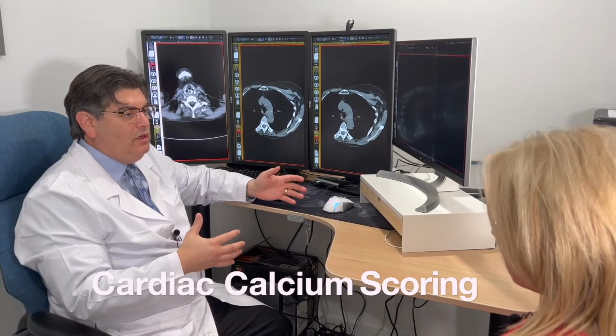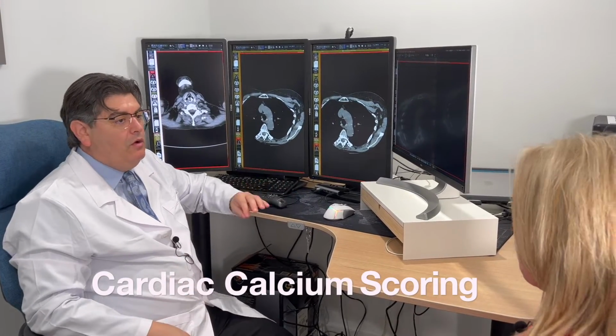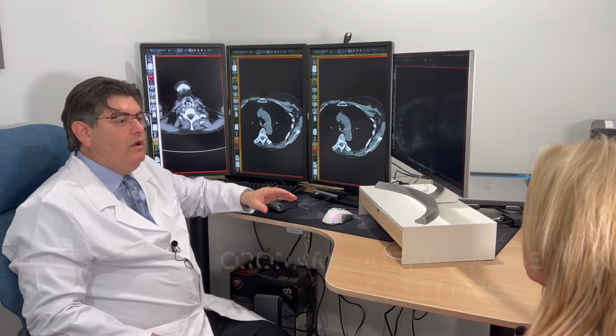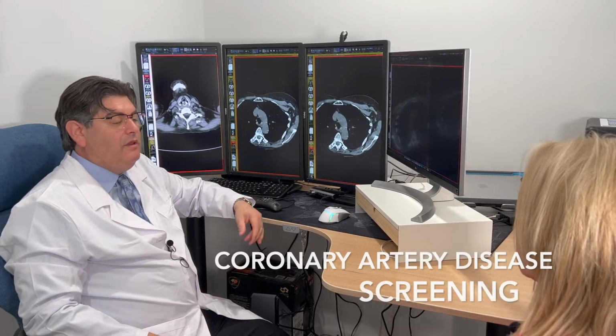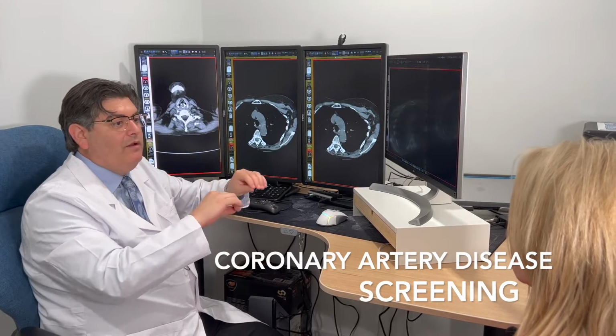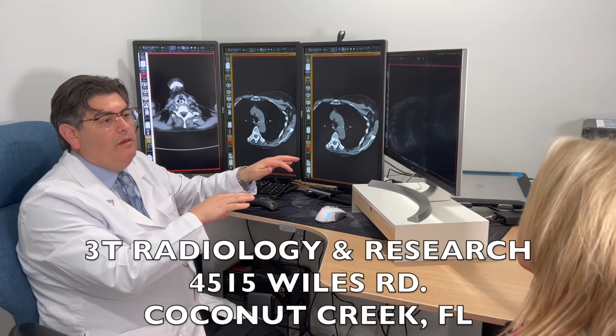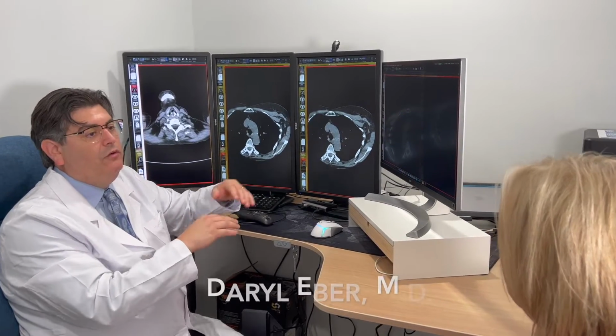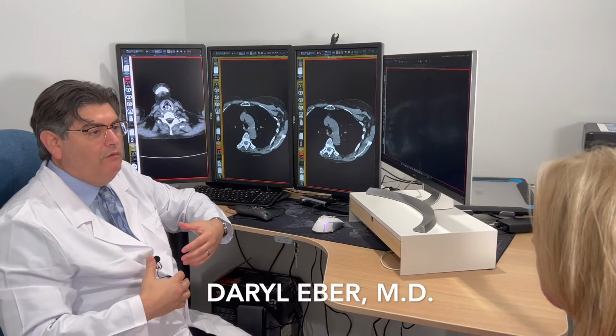Do a screening CT chest, and also we can look at the coronary arteries for the calcium. This is different than when they do what they call a coronary CTA, which is CT angiography. That's where they give you contrast, and they really get a good picture of both the calcified and non-calcified plaques. What they developed is a quicker screening method just for looking at the calcium burden of your coronary arteries.